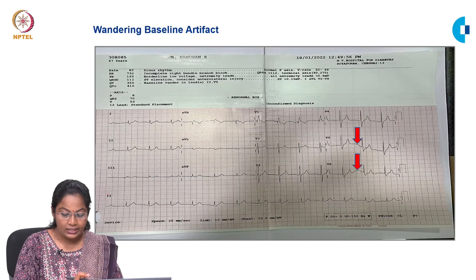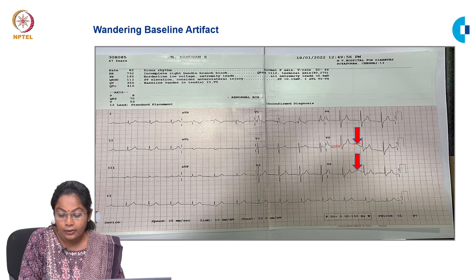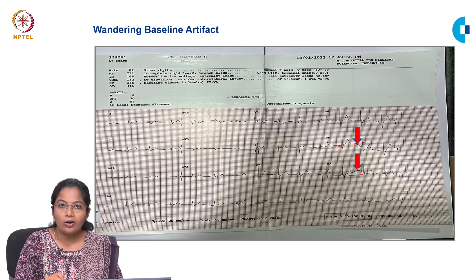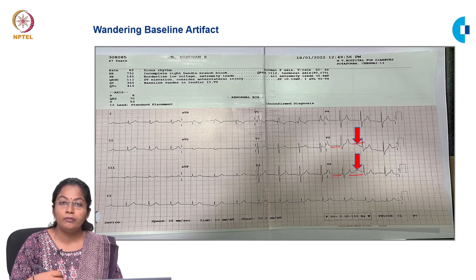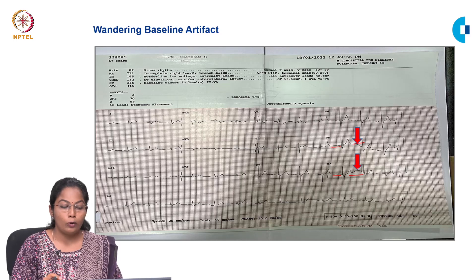In this ECG, the isoelectric line is displaced — instead of remaining at baseline, it wanders above or below. This is called the wandering baseline effect, which could be because of movement of the patient or abnormal respiratory movements. This is also an artifact which can be avoided.